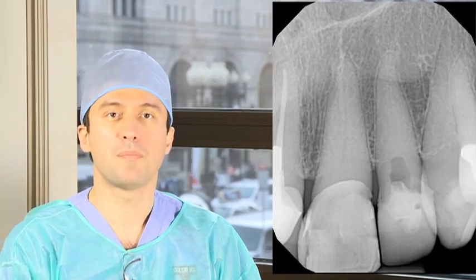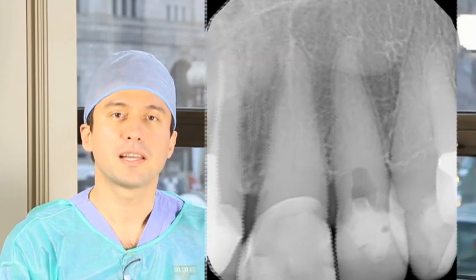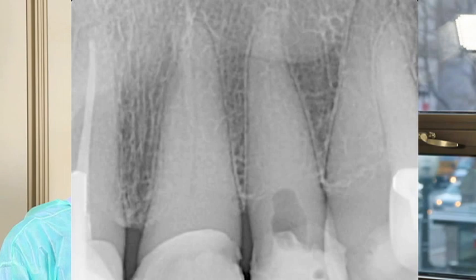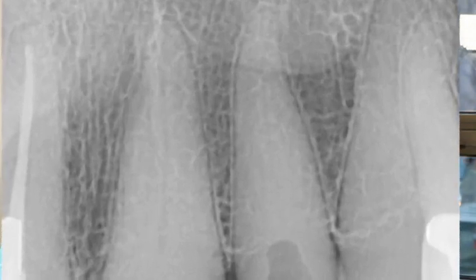This was done because a post base was required for proper restoration of the tooth. Now, there is significant calcification from this angle, as you can see, but there is a hint of the canal remaining deeper in the root. The goal, obviously, is to make the most conservative access given the tapering dimension of the root while minimizing the possibility of procedural errors such as perforation.